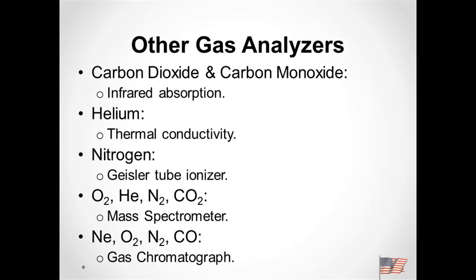One cool thing is something called mass spectrometry, where they basically ionize gas that is being passed, that we're trying to analyze, and as they ionize it, they identify different molecular masses, and from that then they can tell what concentration is there.